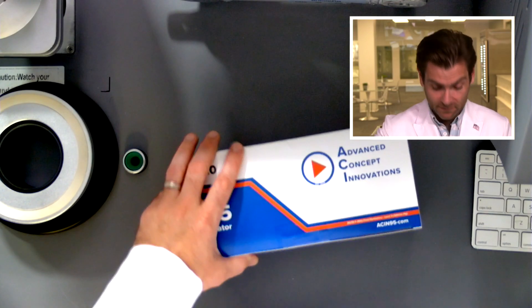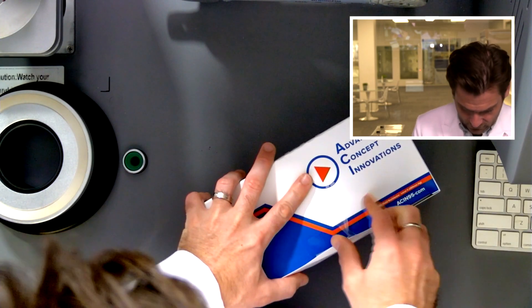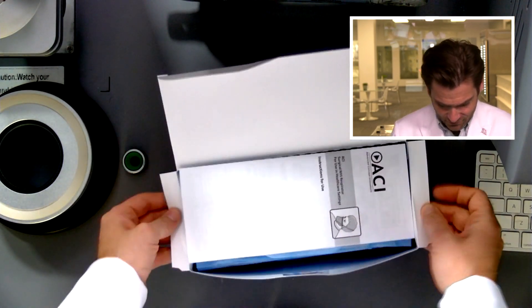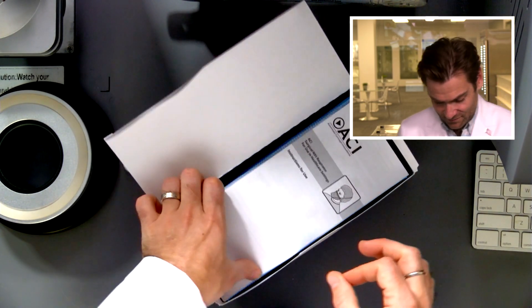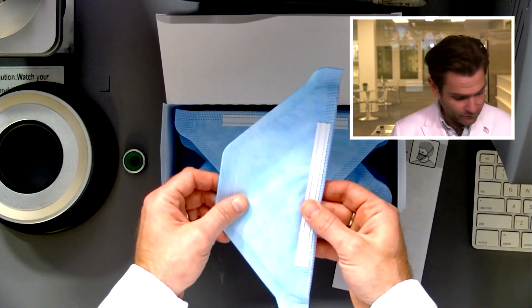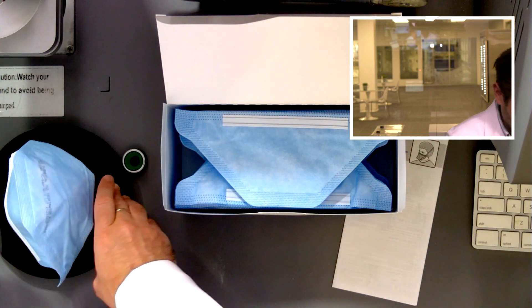Let's get this thing in the clamp and we'll talk about it. It does what a lot of these boxes do — I don't love this, but I know why they're doing it. It makes me feel good that it's sealed. Open it up — wow, look at that! They made their pamphlet exactly the size of the box. You open it up and it looks like you've got 50 respirators right in here.